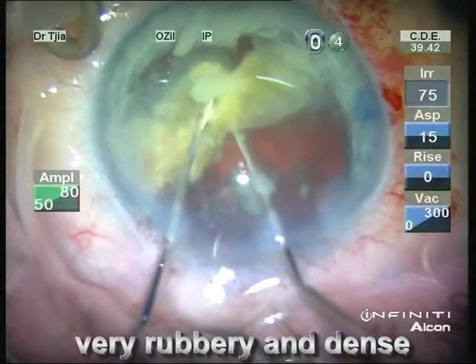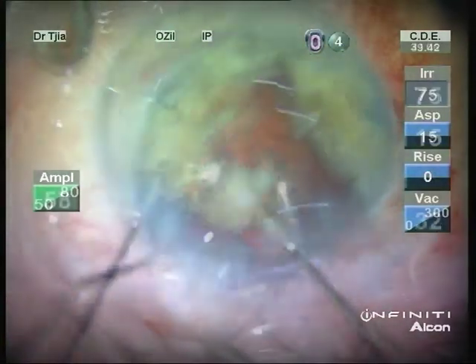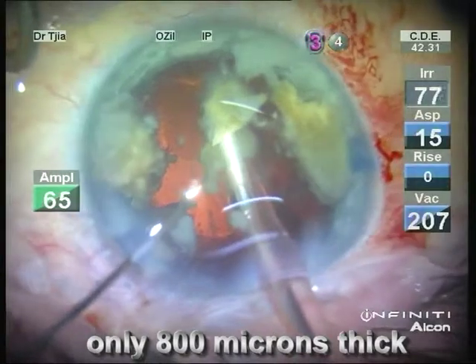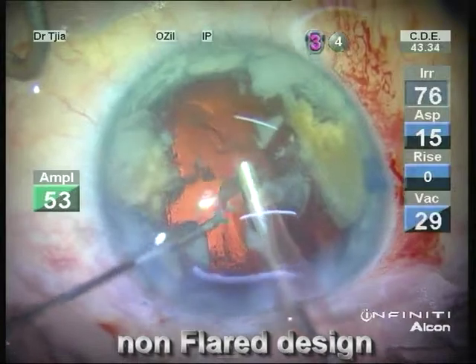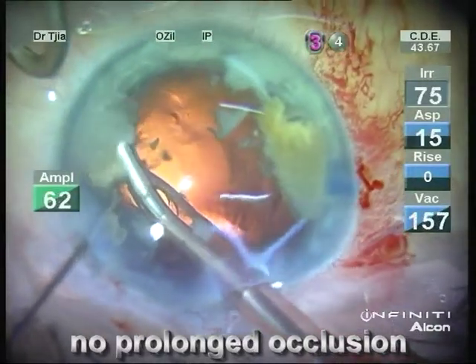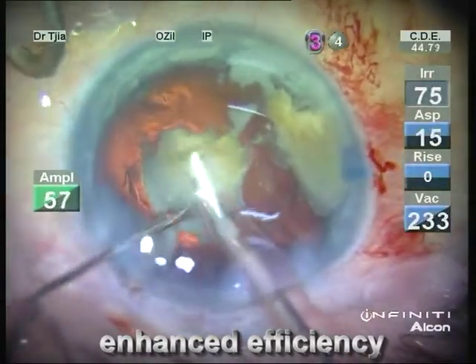This is indeed a very rubbery and dense nucleus. You can now witness the emulsification of this dense nucleus by the new 0.9 mini tip, which is only 800 microns thick with a non-flared design, not showing any periods of prolonged occlusion, leading to enhanced efficiency and safety.